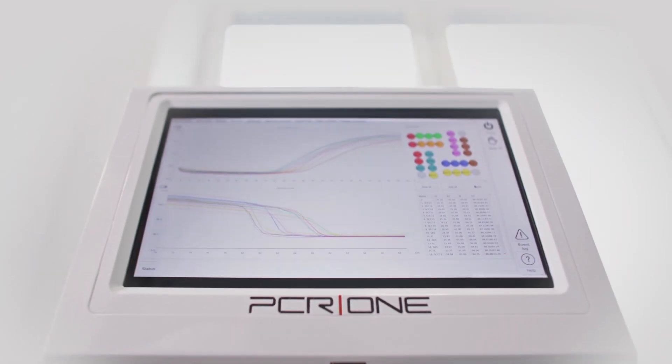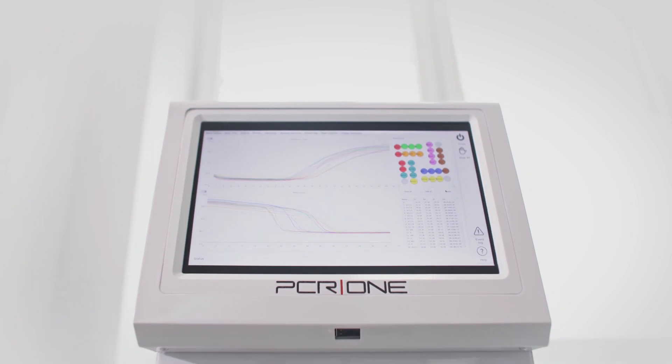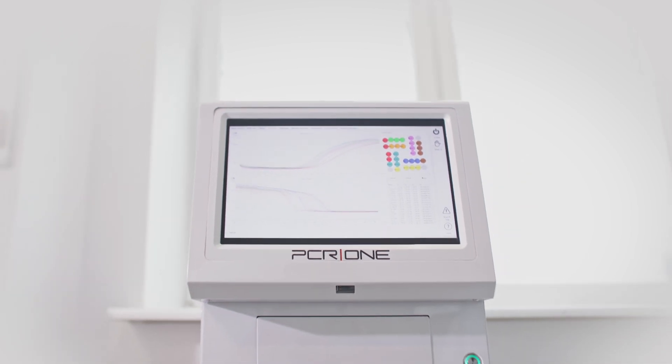Before you perform the test, make sure that the PCR1 analyzer is turned on and ready to accept samples.